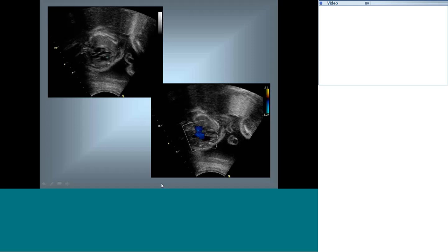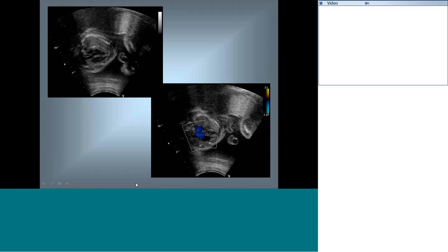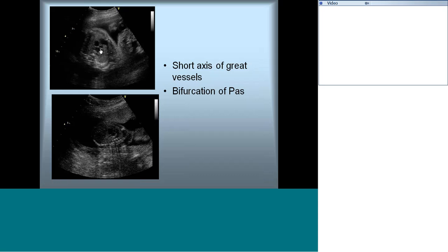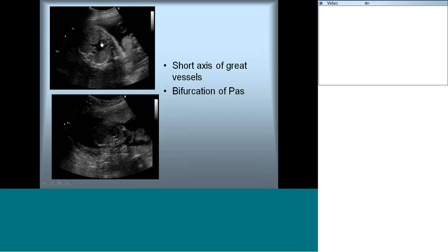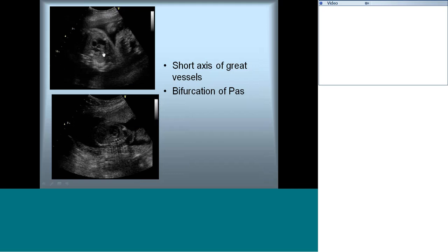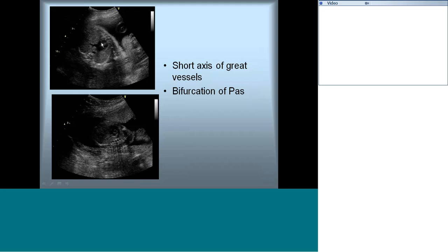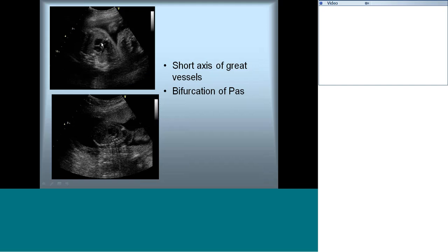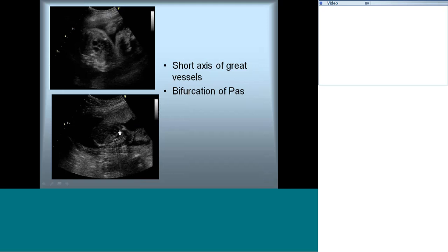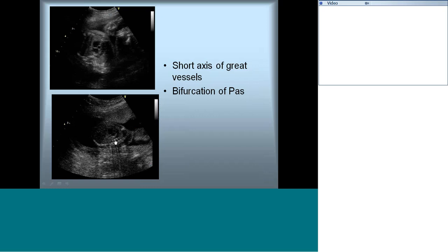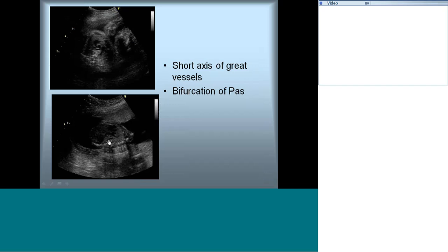This view is similar to the parasternal long axis. Rotating 90 degrees from here gives a parasternal short axis-type view. In this view you get the aorta in short axis and can see the branch PA bifurcation, the left atrium, right atrium, and RVOT. VSD can be well defined in this view. A slight tilt from here will open up the ductal arch continuing as the descending aorta, visible as the right ventricle outflow to the branch PA and descending aorta.